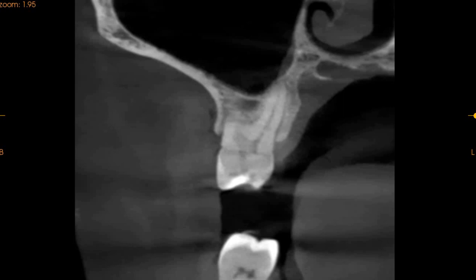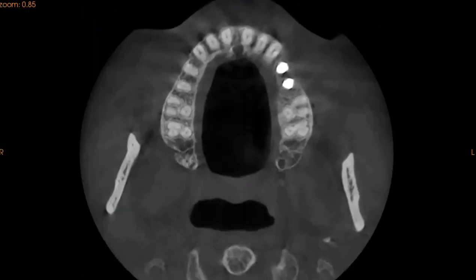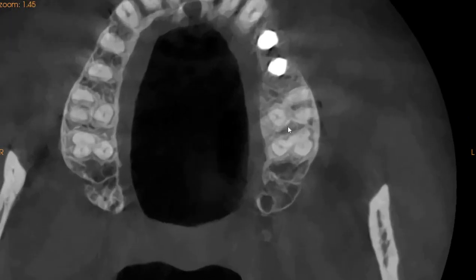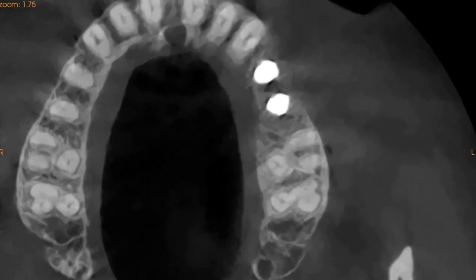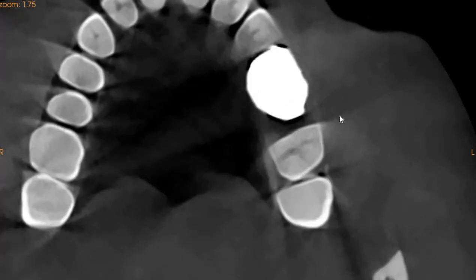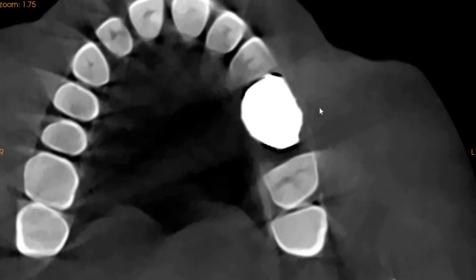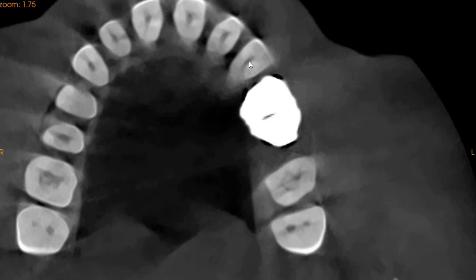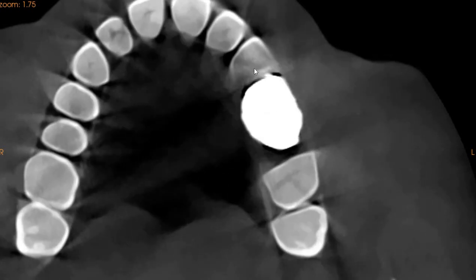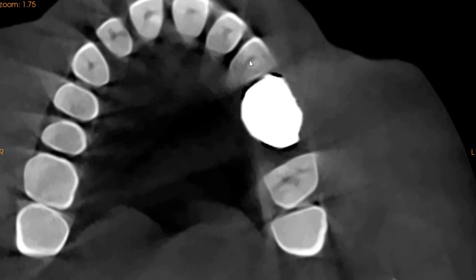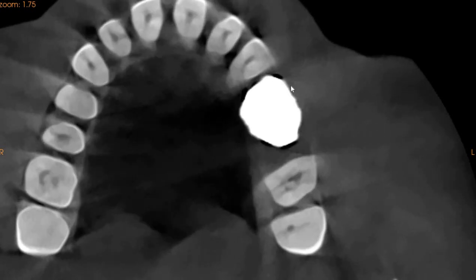Taking you to the axial view. On the axial view, we can clearly show you — so this is how the axial view looks. This is the cavity on the canine; that's where the cavity is. It's touching the pulp — that's the pulp right there, this is where it's connected.